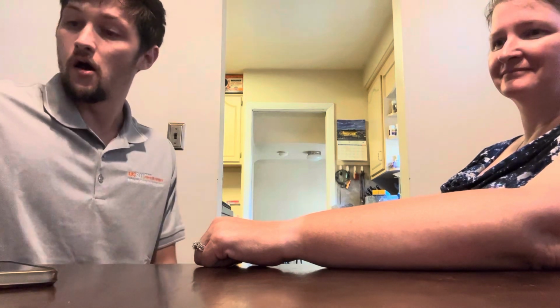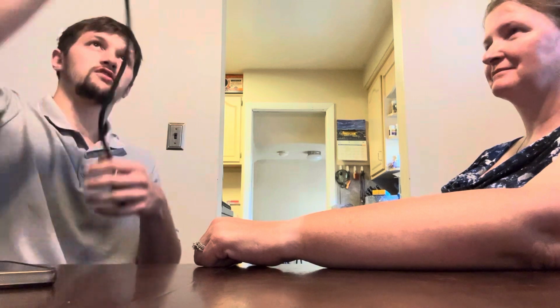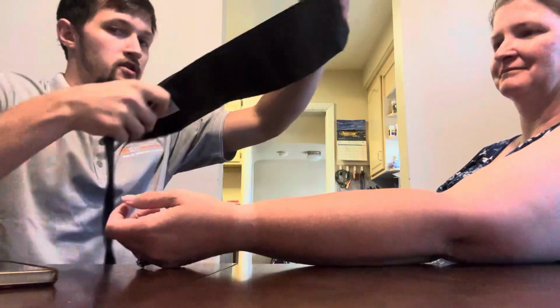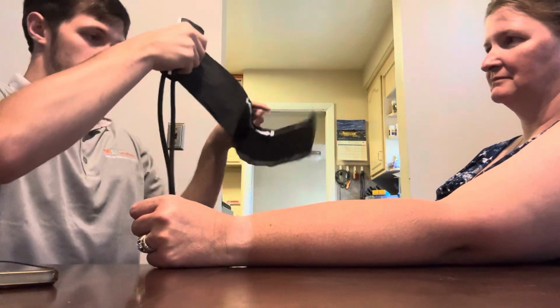So the next test we're going to do is the blood pressure test. So the first thing I'm going to do with this is measure to see that it's about the right size, which it is. And then I apply this to the left arm.